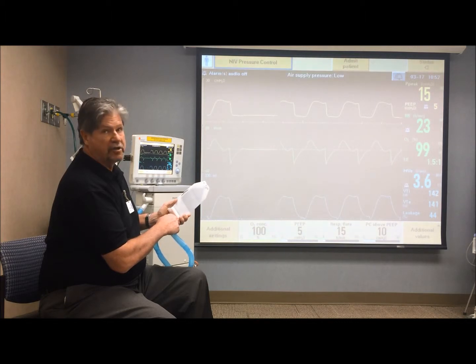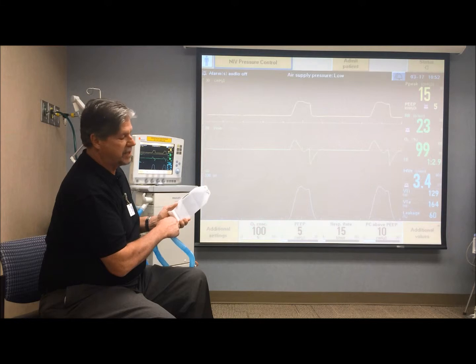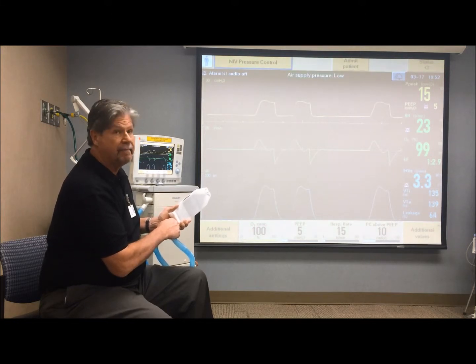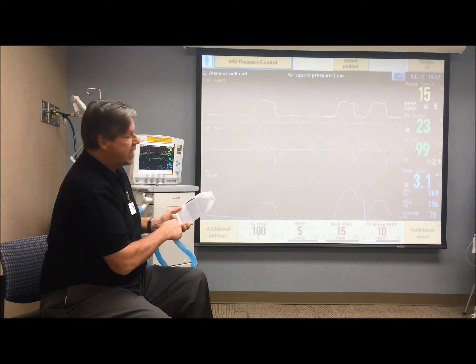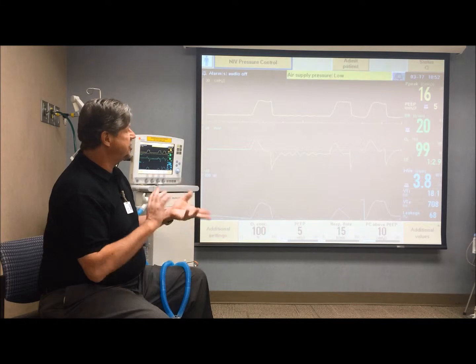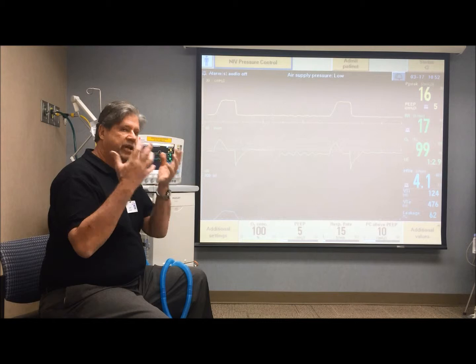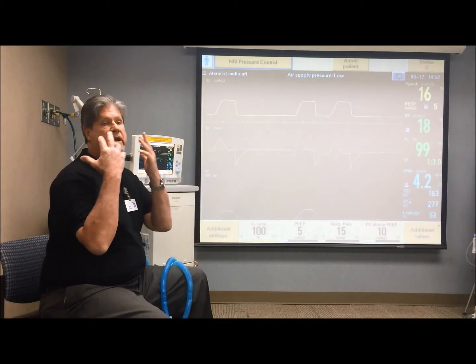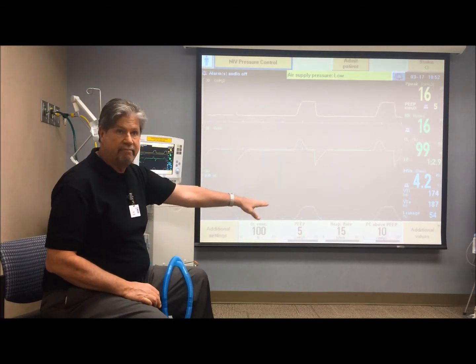After a few auto-cycle breaths, the ventilator stops auto-cycling. Because what it's done is it's learned the new base flow and it's adjusted its inspiratory sensitivity, okay? So if it leaks a little bit more, it'll auto-cycle again, and now our leakage is 72%, okay? Then the leak seals up, and now the sensitivity changes, and the leak percentage will go down. As that leak occurs, the ventilator will deliver up to 65 liters per minute of flow to try to maintain the settings that we have set.